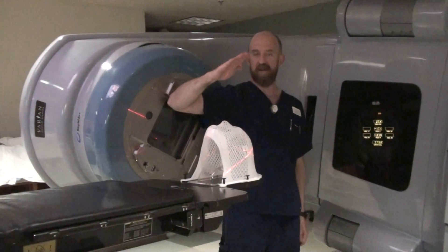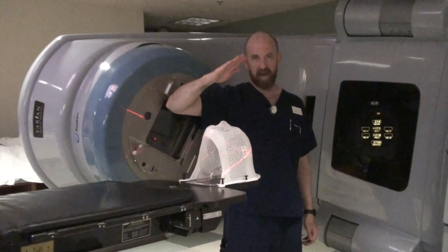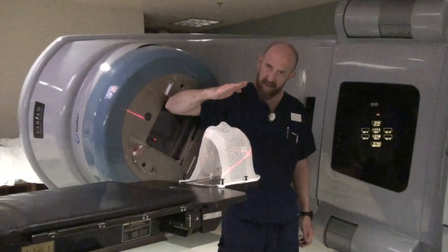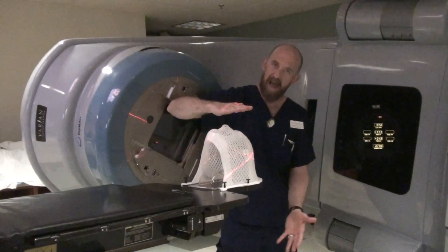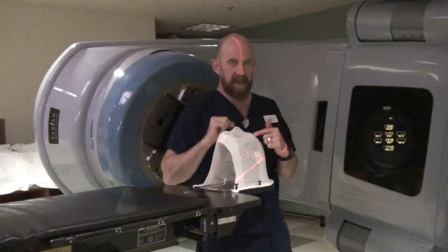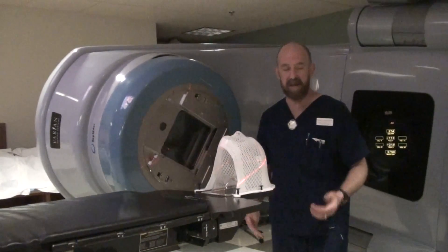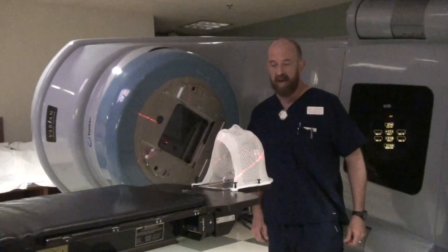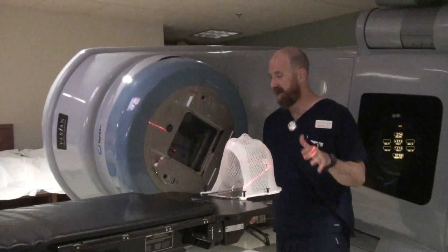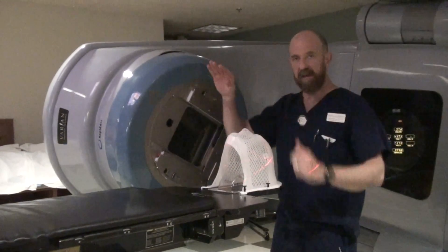It flattens it out. So instead of having divergence that looks like this, when you rotate the gantry up, it actually flattens that anterior divergence out, so you don't have that divergence into the opposite eye. Hopefully that makes it more clear than my drawing and lecture did. So you have divergence, and then it gets flattened out because you have angled the gantry up.